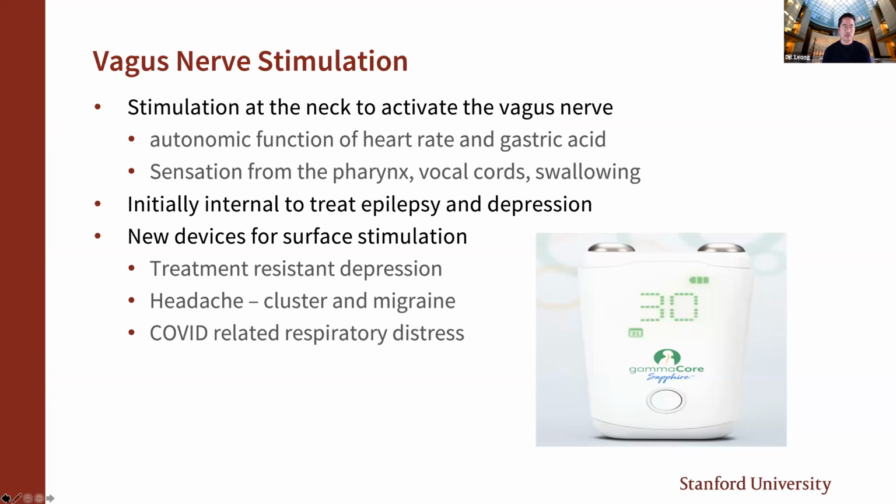And there's some data for cluster headache and treatment of migraine using neurostimulation at the neck, not even inside the body, just at the neck itself. You can self-administer it with some guidance and some instruction. And the last part, which will hopefully surprise many of you, is that it can actually be used to treat COVID-related respiratory distress.